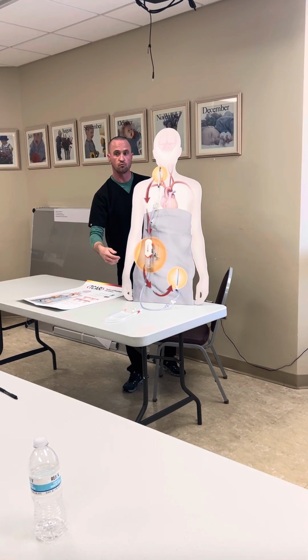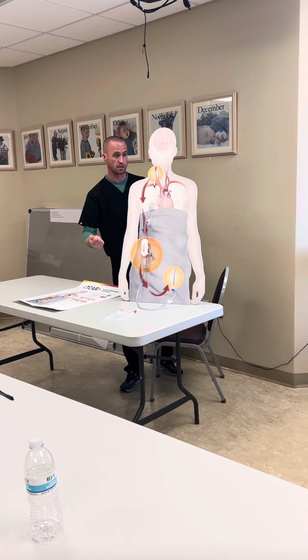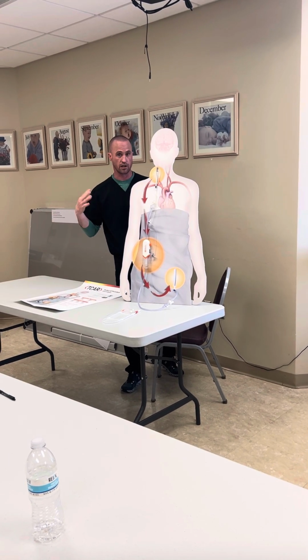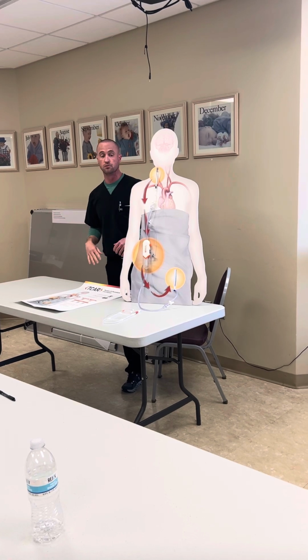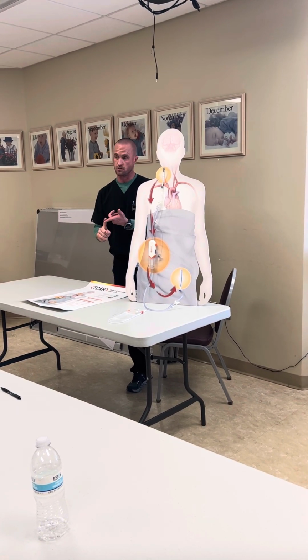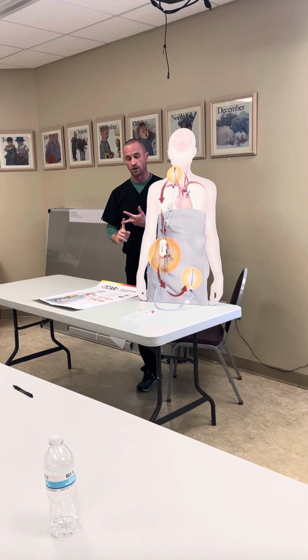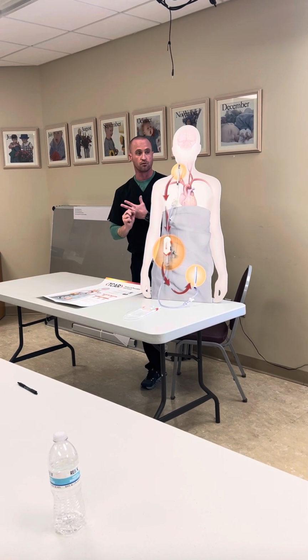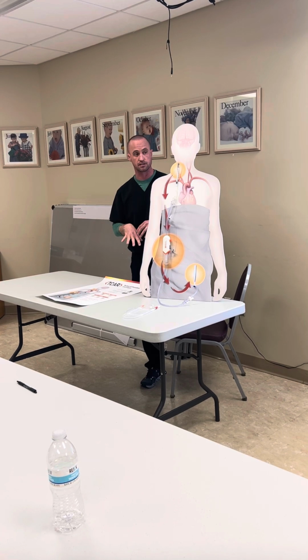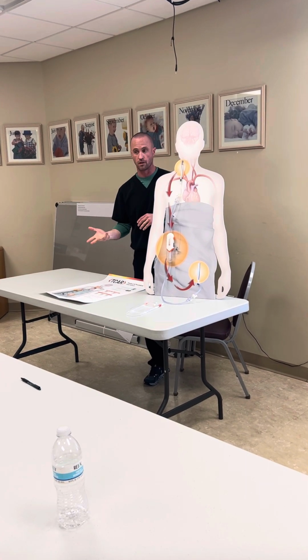Once all that's done, we'll shoot a working view, which is basically a contrast angio. We'll mark everything on the screen. We agree on where we're going to deploy the stent and balloon, and then you'll hear us do a TCAR timeout. We'll say, hey, we've got pressures in the 160s, heart rate's good, ACT is above 250, which Dr. Reiser does a good job of, heparinizing and doing the ACT early, so we're not waiting on it when we're ready to clamp.